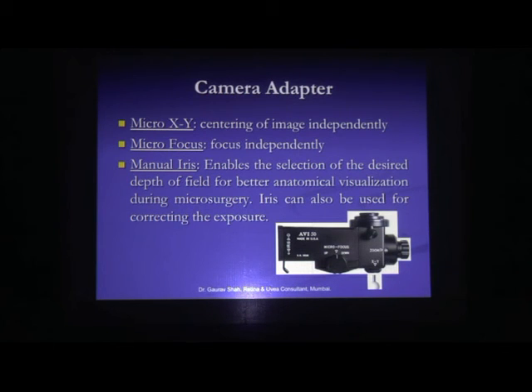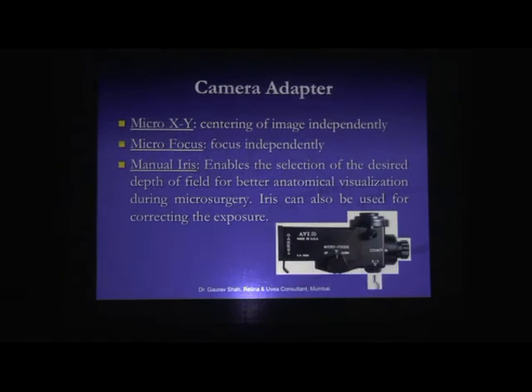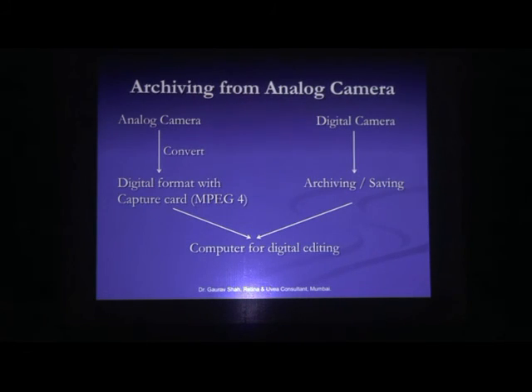Usually in such a setup, besides the surgeon, there will be an assistant on the side who will keep monitoring what is seen on the television screen, and without disturbing the surgeon can independently manage the focusing, the field of view, the contrast and other aspects. This can also be controlled with the help of a remote control. This tube is available in the US from an Israeli scientist called Avi.